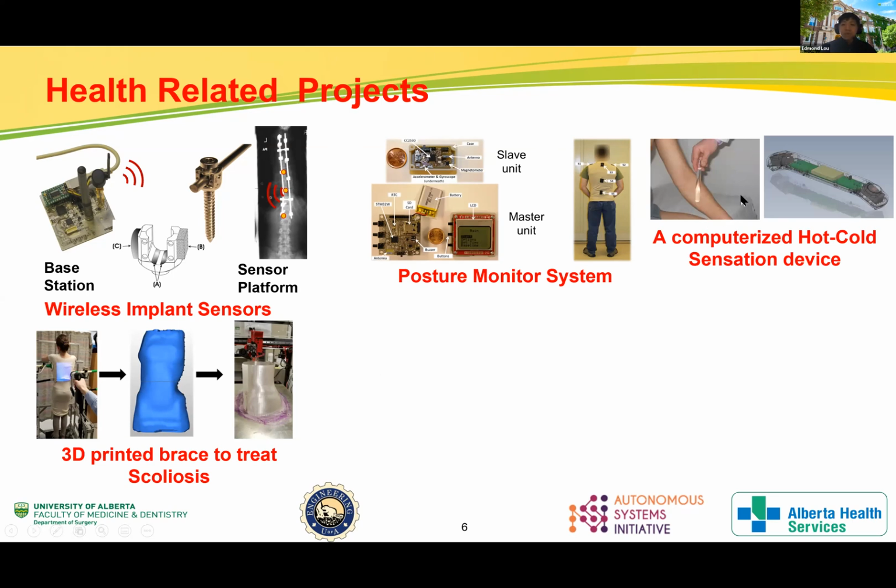Another commercial product, also initiated by a company and clinicians, is a computerized hot and cold sensation device that allows us to do assessment on patients who have diabetes.